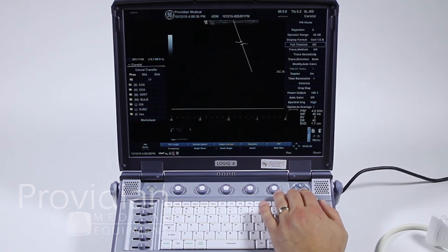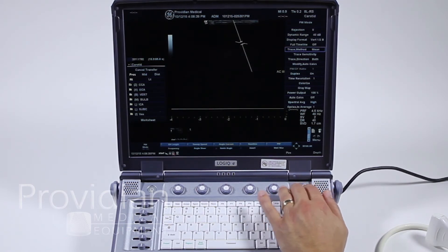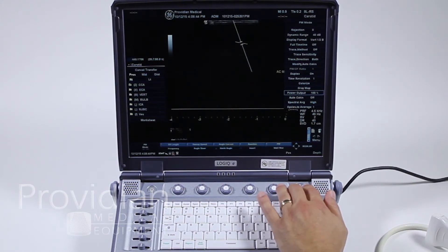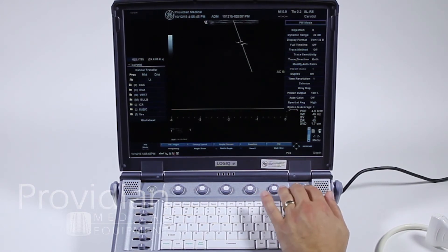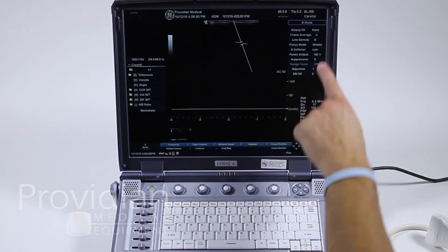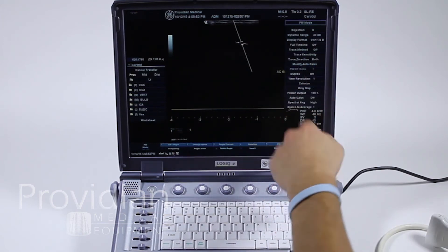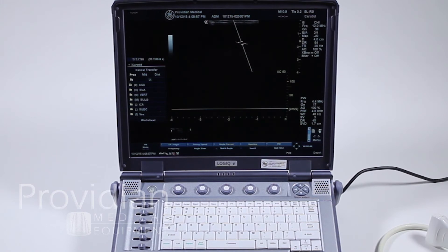Dynamic range, rejection, timeline, trace method — if you want to go to max, mean, or off — trace sensitivity, and a whole slew of different things that you can do. I've got duplex set to on. I can go up to the top where it says PW mode, click to the right, and it's going to give me parameters that can change B mode. If I was in color and kept clicking to the right, it would show PW, color, and B mode up on that menu. The menu will just disappear if you don't touch anything for a while.